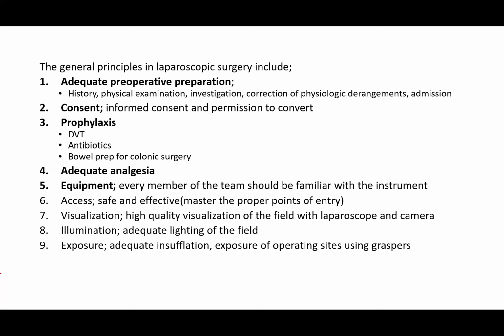Now, there should be adequate analgesia and equipment. Every member of the team should be familiar with the instrument, because if the perioperative nurse is not familiar with the instrument, the surgeon is going to suffer, and the procedure is going to take an extremely longer time.